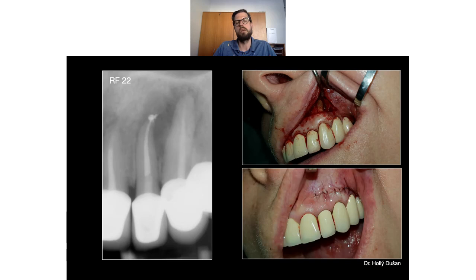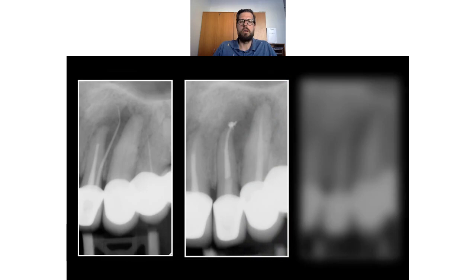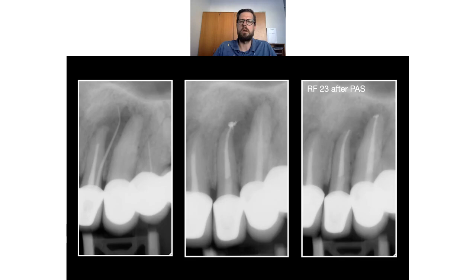And if you have such a case, there is a good chance that it's not able to be done only by endo from the crown. You must go also from the root end. So this was before and this was after, and you see that after 1 month, I was able to do the endo, and you see that the inflammation is already gone. And the funny thing is that this is the only case where the puff disappeared after some time. No, I'm just joking. The puff was removed by the surgeon.